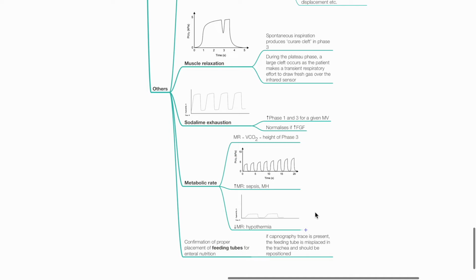Confirmation of proper placement of feeding tubes for enteral nutrition. If capnography trace is present, the feeding tube is misplaced in the trachea and this should be repositioned.